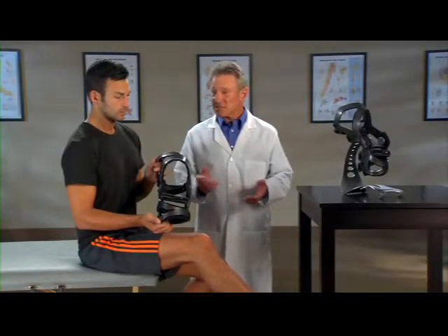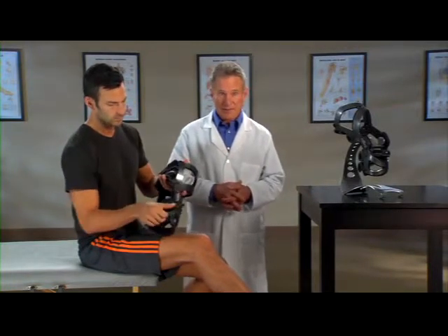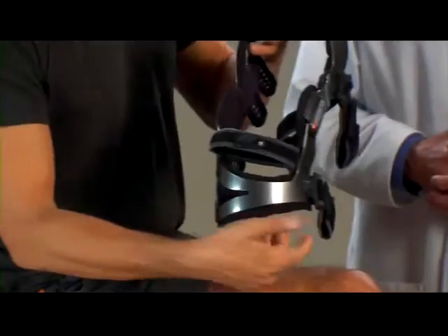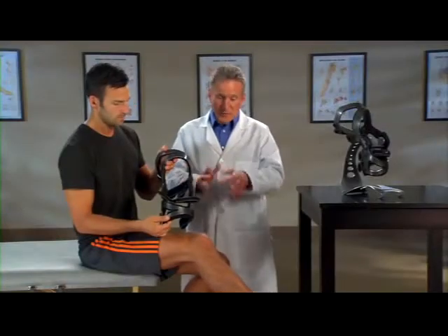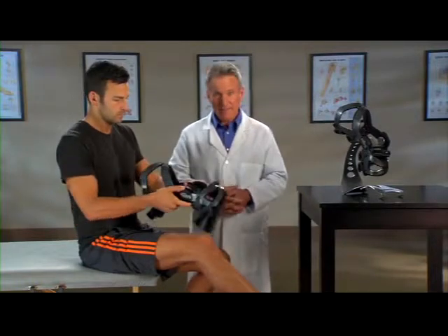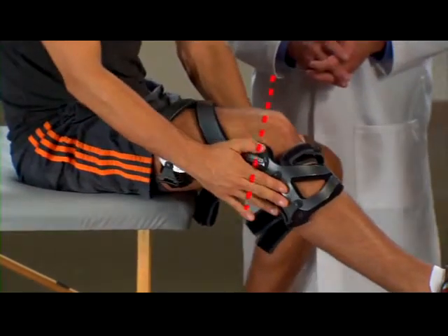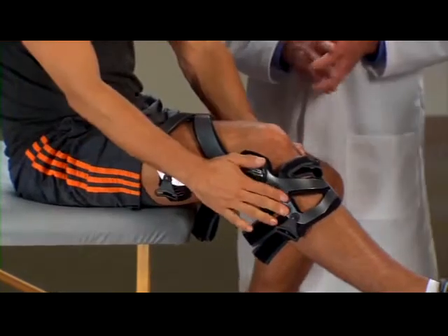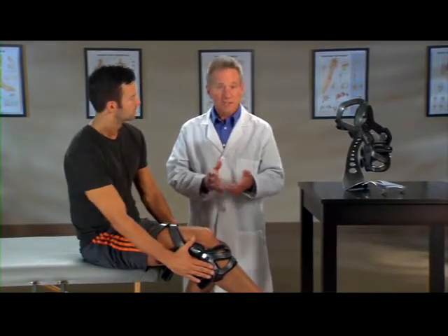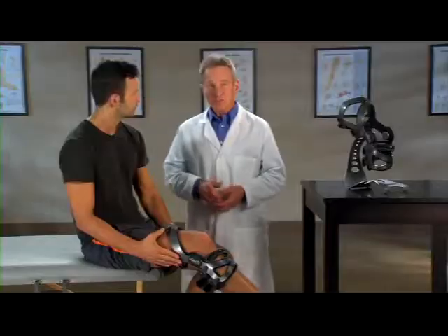The LPR knee brace is easy to put on. Start by unfastening all the straps except for strap number three, which can just be loosened. Folding the hook-loop tabs back against the straps will stop the straps from getting tangled. Sit with your knee bent at a 30-degree angle in a gas pedal position. With the brace fully extended, slide it down onto your leg. Position the brace so the center of the hinges align with the top of your kneecap. The hinges may be positioned behind your bent knee — this is normal. You'll see that as you fasten each strap, the hinges will move forward until the brace is properly positioned on the leg, slightly behind the midline of your knee.